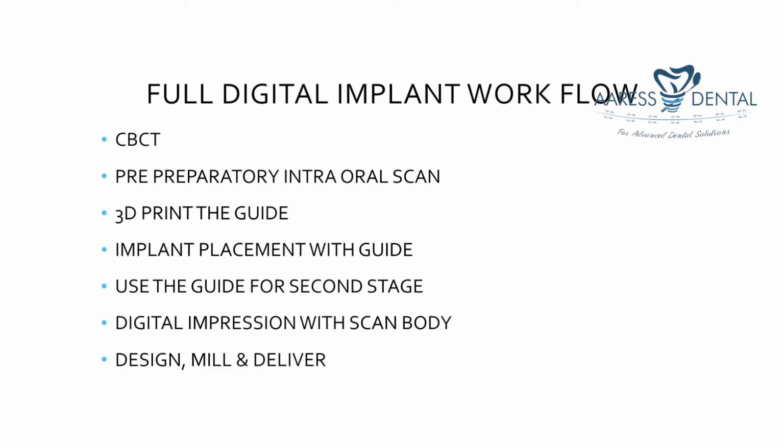The full digital implant workflow starts with a cone beam CT, followed by a pre-preparatory intraoral scan. Then the CBCT and the scan are merged in specialized software like Implant Studio or Exoplan to plan the exact position of the implant.